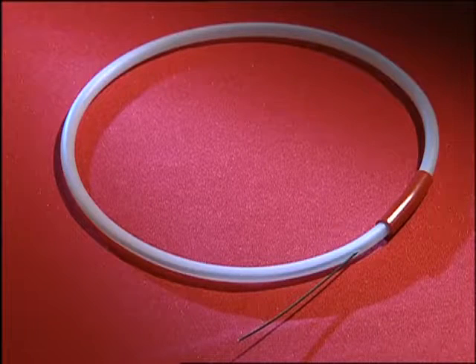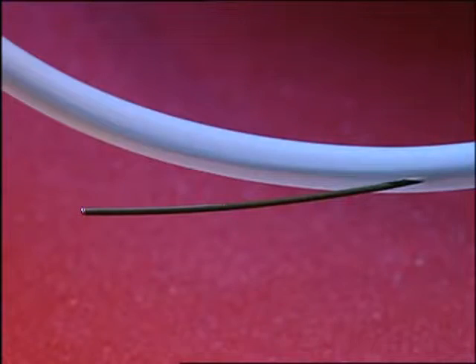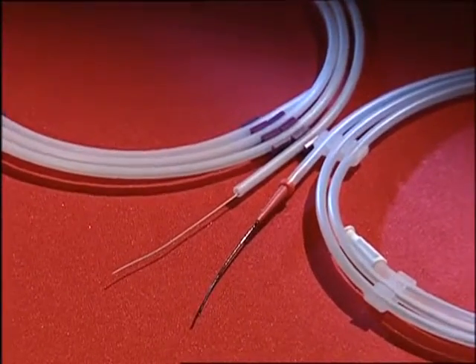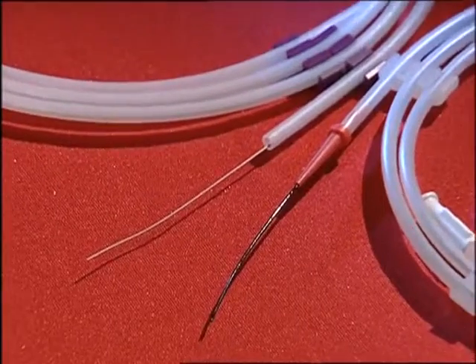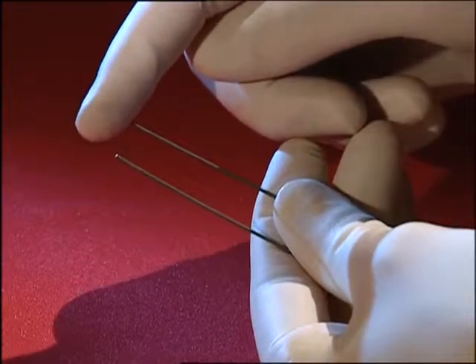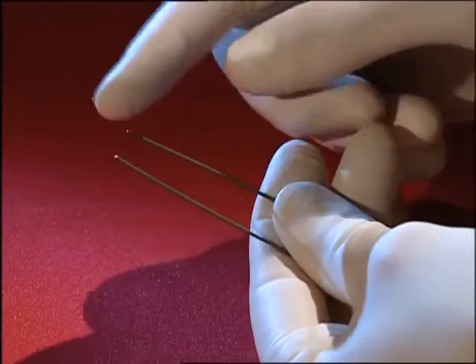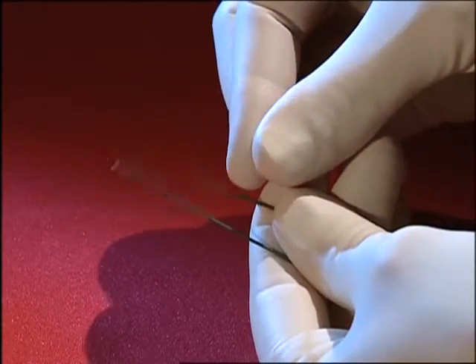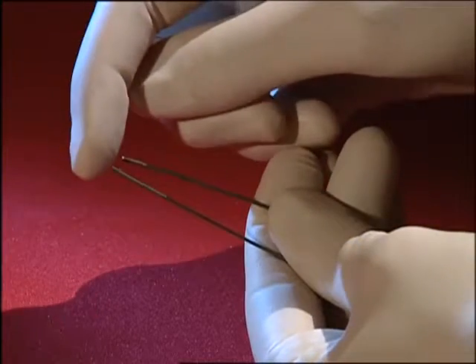Numerous types of wires have been developed and have meanwhile become an indispensable tool for flexible ureterorenoscopic procedures. Because of the length of the endoscope, the most useful of these are 150 cm long. The 0.035 and 0.038 inch diameter are the most commonly used wires. They have a flexible distal and a rigid proximal tip.